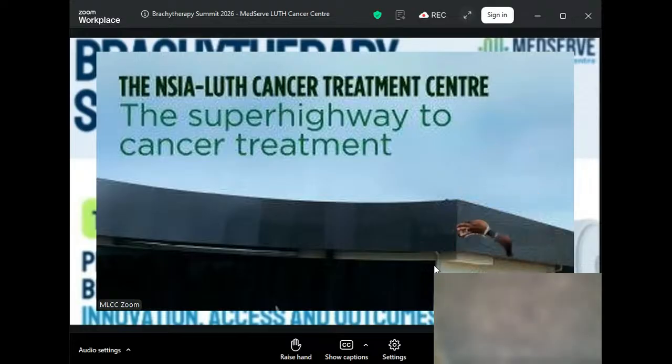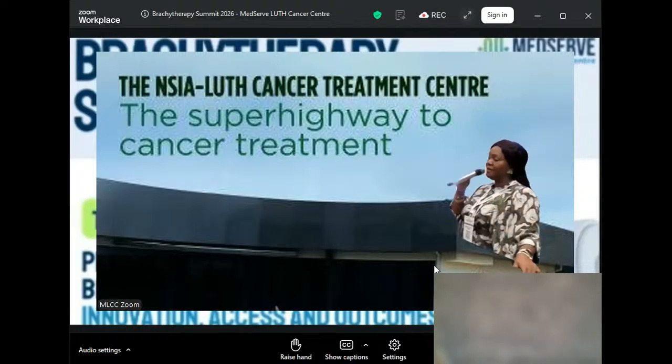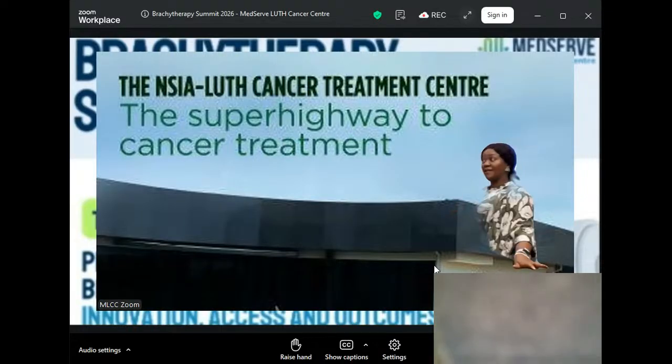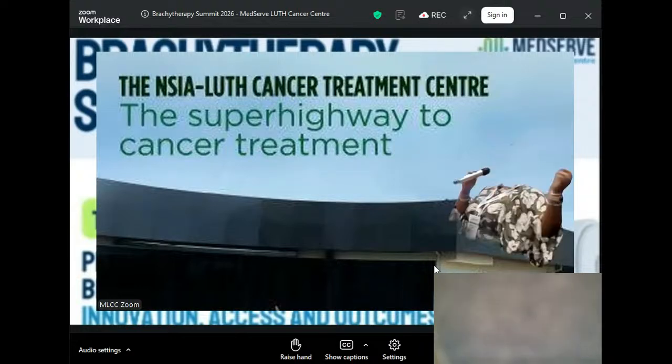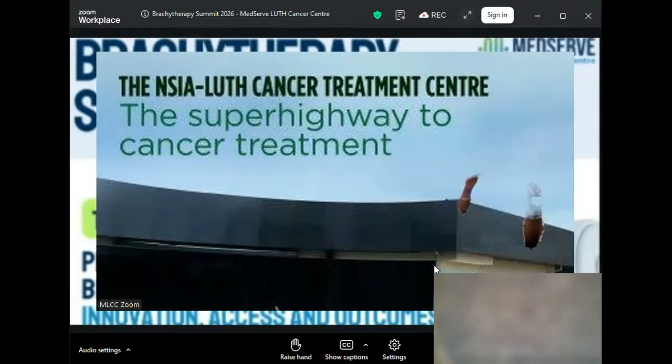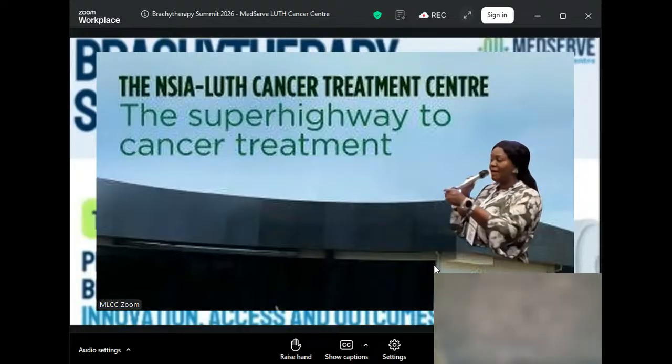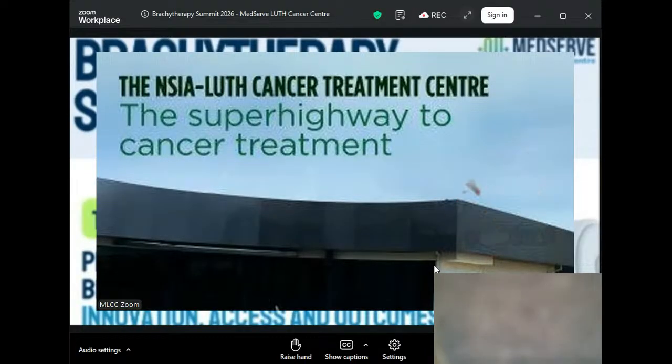For this summit, we planned freehand insertion under the guidance of those knowledgeable and experienced, only to discover that the needles, some donated by HIT following the last summit, are not sharp. We were going to place them manually, and I believe all of us now understand that when you place them manually, without experience, it is not even going to work.